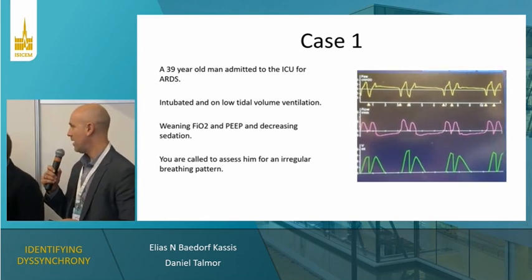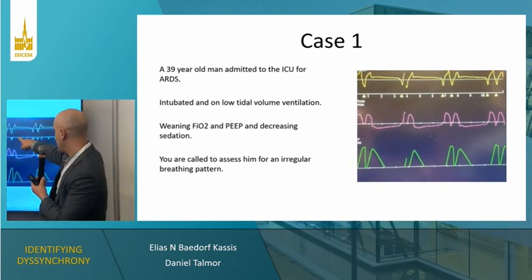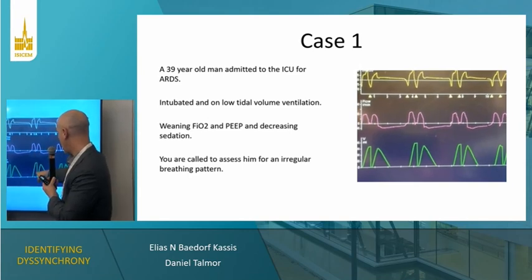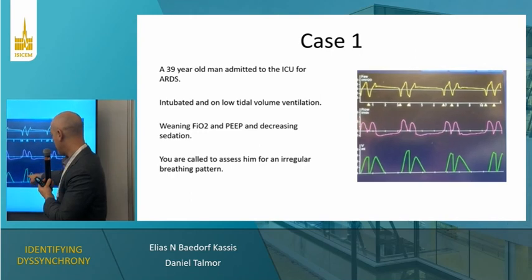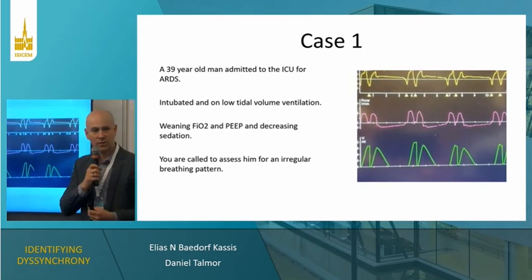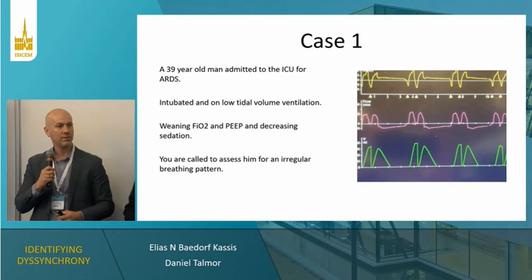Here we go. Here you can see these 2 breaths that are stacked one after another. And what you can see here is that the ventilator delivers the first breath and then actually artificially re-zeros the volume before the next breath as well. And so anyone in the audience have any ideas about what we're seeing here?